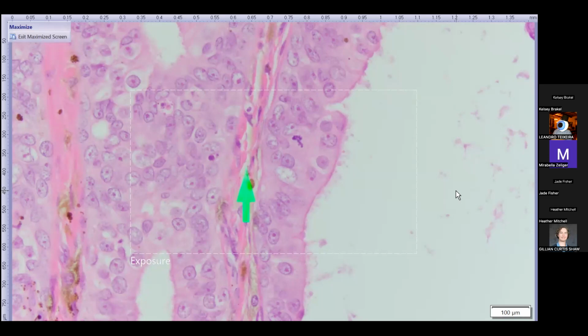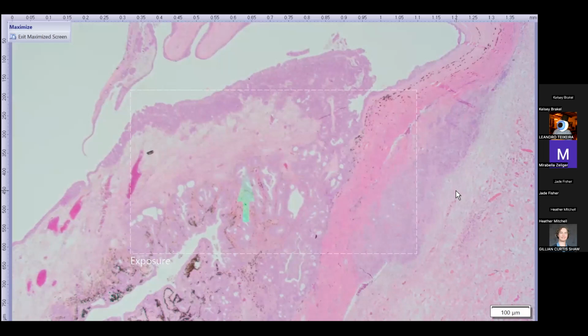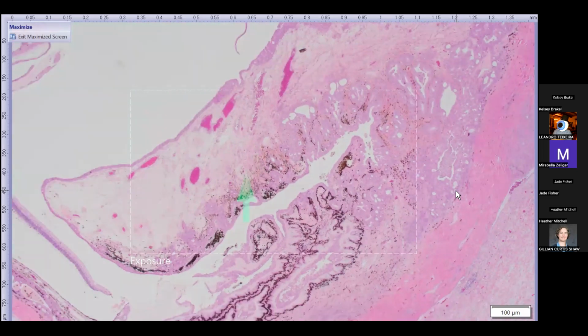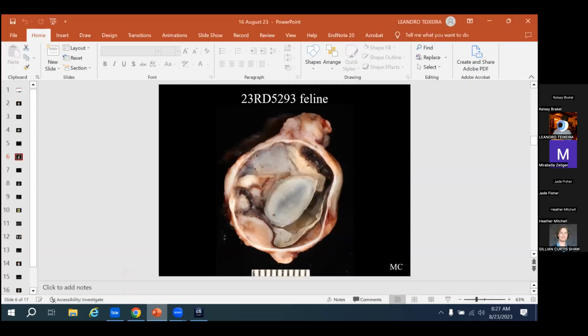And to review again the features of metastatic neoplasm, which is why I call this metastatic carcinoma, the extensive carpeting of the intraocular surfaces is part of what we call metastatic pattern in this case as well. So this is a metastatic carcinoma in a cat with the feature of that nice ciliated border of the cells.